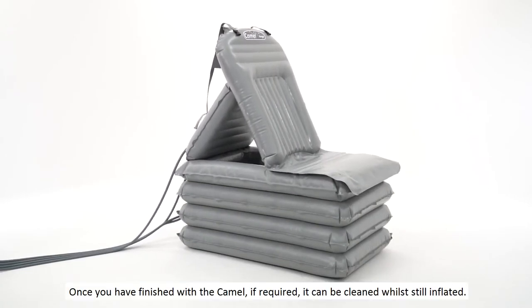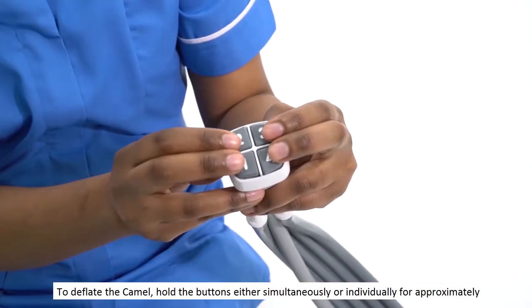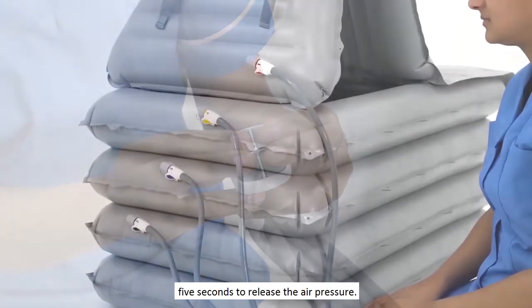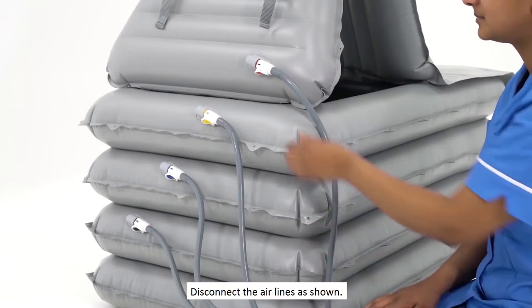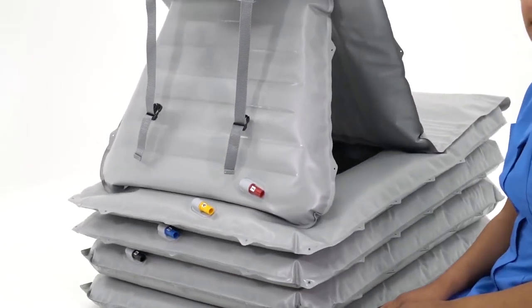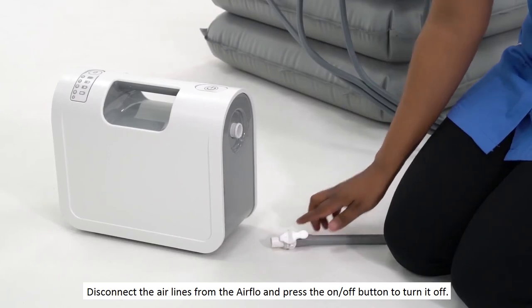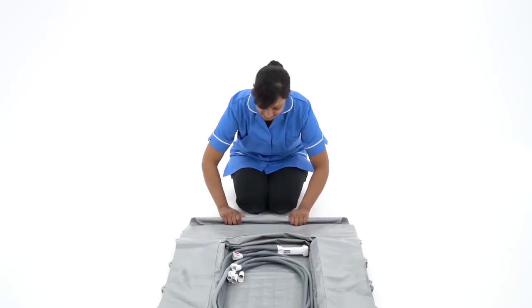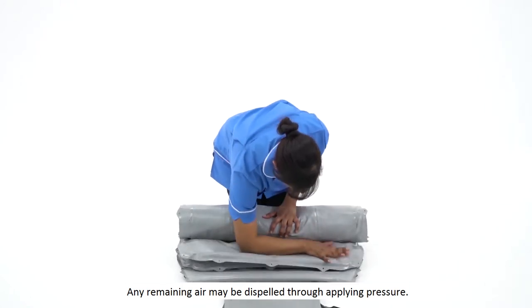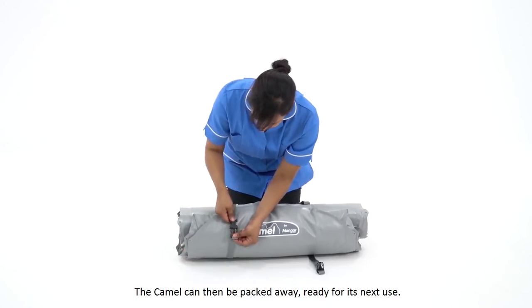Once you have finished with the Camel, if required, it can be cleaned whilst still inflated. To deflate the Camel, hold the buttons either simultaneously or individually for approximately five seconds to release the air pressure. Disconnect the air lines from the airflow and press the on-off button to turn it off. Any remaining air may be dispelled through applying pressure. The Camel can then be packed away ready for its next use.